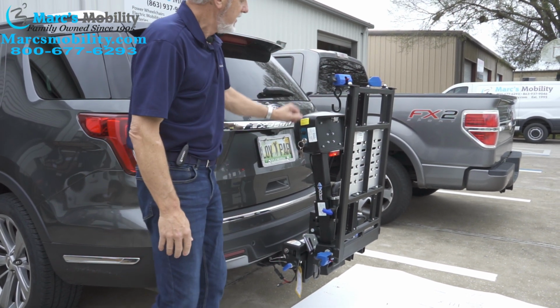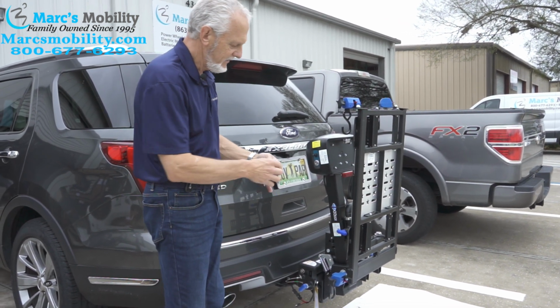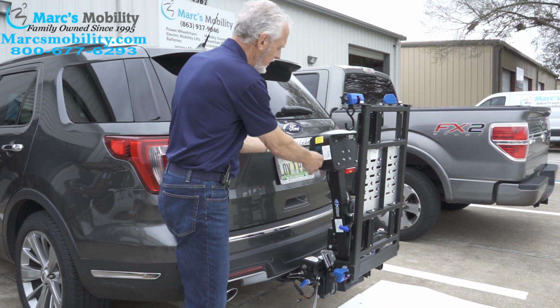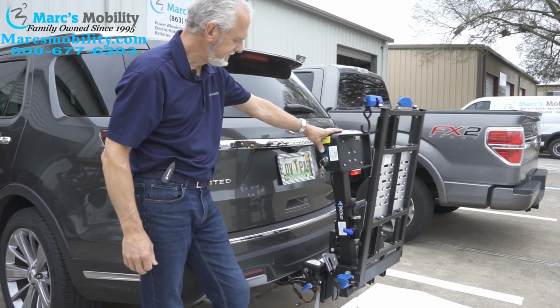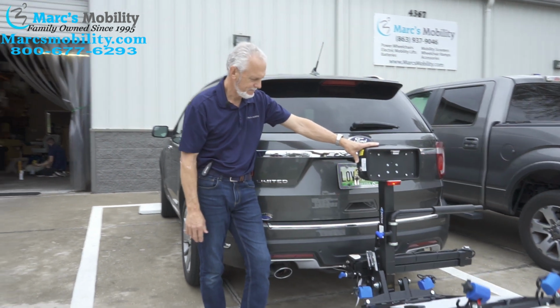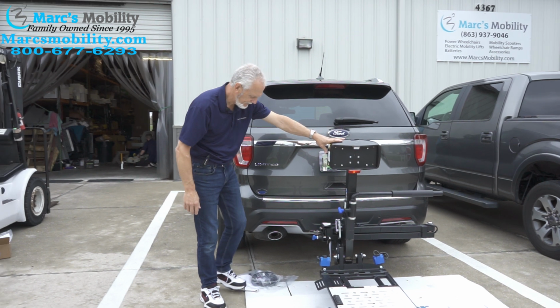Now, the only thing you have to do with this lift, you get 2 keys with the lift, is just put the key in, turn the key to the right, and the light will come on over here to show you have power. Push the button down, and the platform will come down automatically. Now you will go down with the platform.